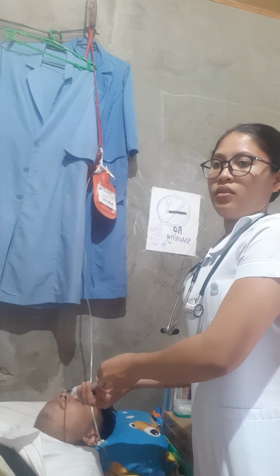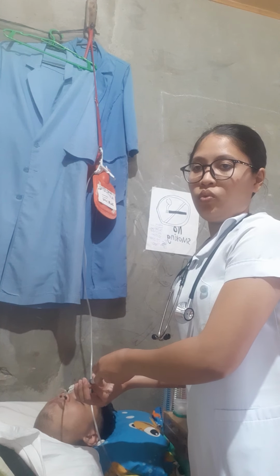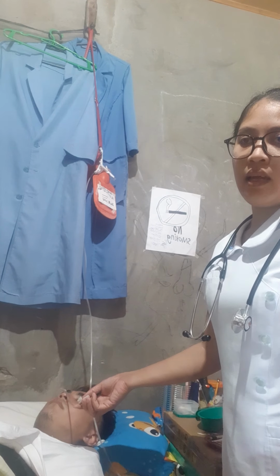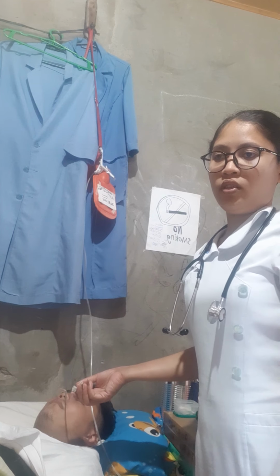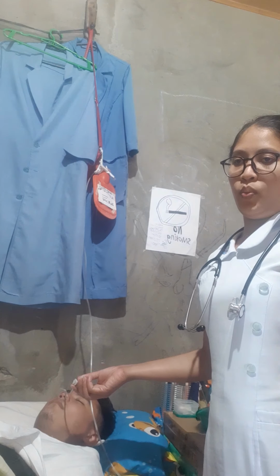So we need to instill 50 to 100 ml of water through the feeding tube medication port, because instilling water flushes the lumen of the tube, preventing future blockage by the sticky formula.